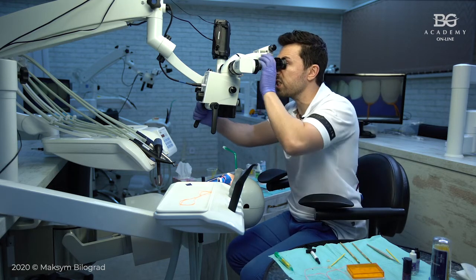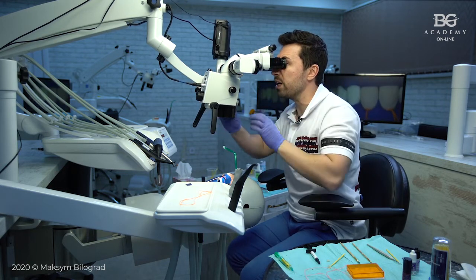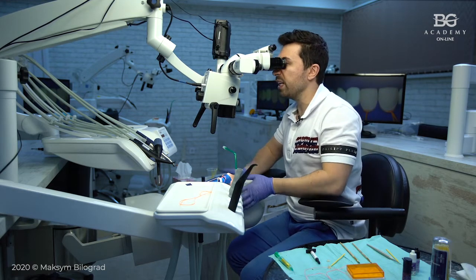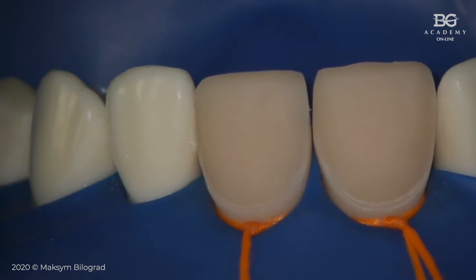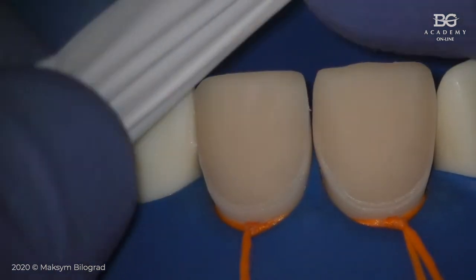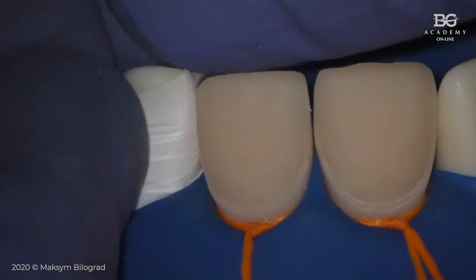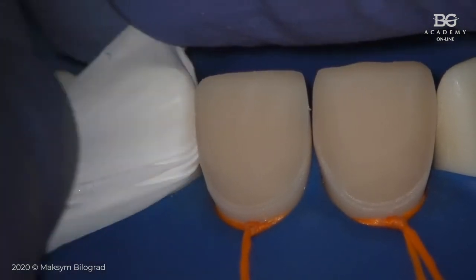tooth preparation. As we decided in this case, I will cement one veneer only, and then another one. So to make predictable bonding process, I have to protect adjacent teeth in front of etching and in front of bonding.